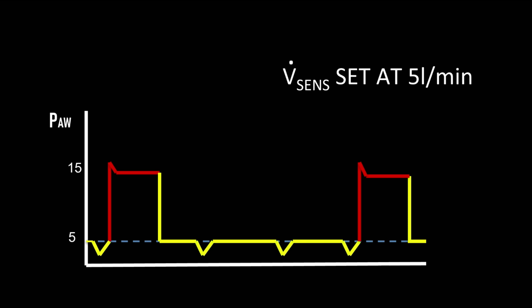Clearly this is pressure support ventilation, the red waveform with the little nip on the top and then a flat surface tells you it's pressure support, so the first breath looks normal. But there's something missing. These 2 breaths here are not being triggered. So the patient is trying to breathe, but not every breath is happening. The patient is asynchronous. They are under-triggering.